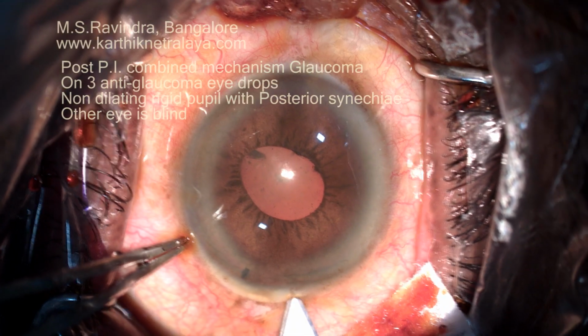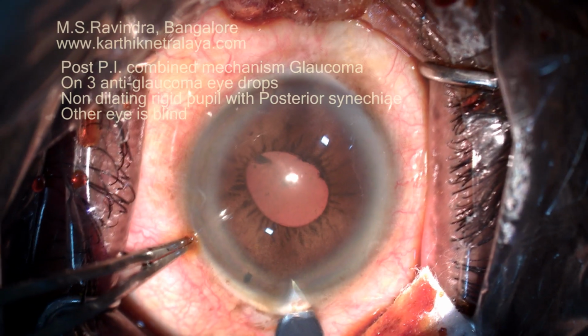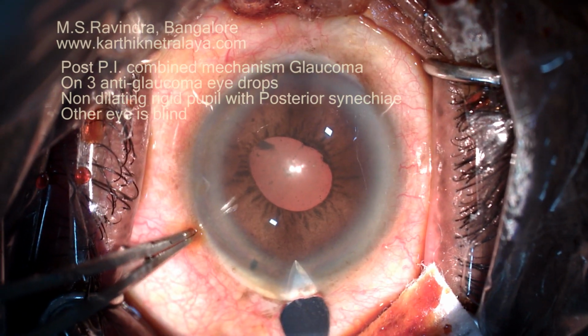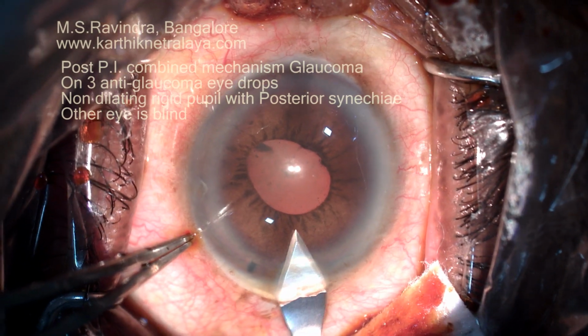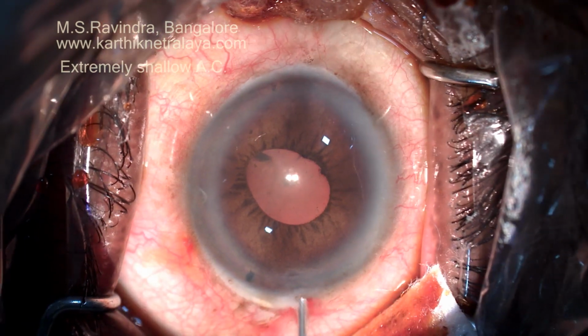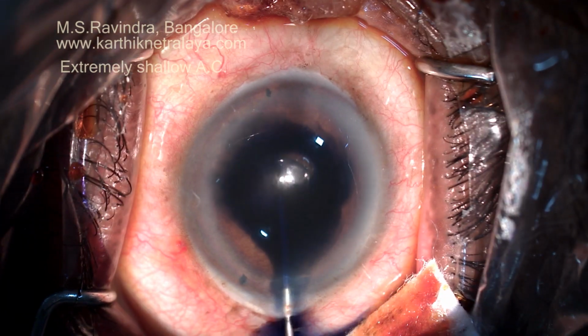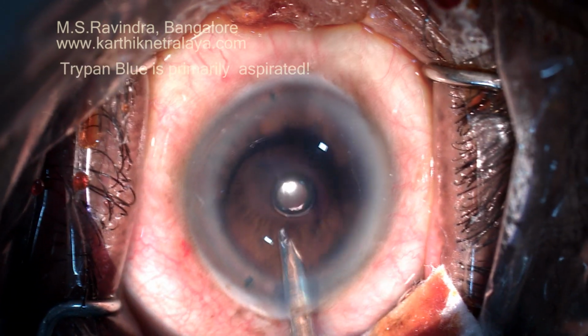A one-eyed person had advanced glaucoma due to combined mechanism. AC was extremely shallow. He was on 3 anti-glaucoma eye drops with poorly controlled intraocular pressure, very advanced glaucoma changes in the visual fields. He had few attacks of angle closure. PI was done at 2 areas.